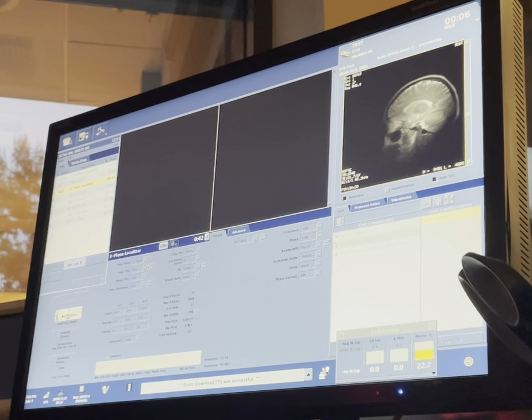Yes. Okay, cool. We figured it out. We didn't need that whole first coil change. Just gotta make sure you click in the right coils over there. My bad, guys. Okay, we're officially good now. Okay, so extra.